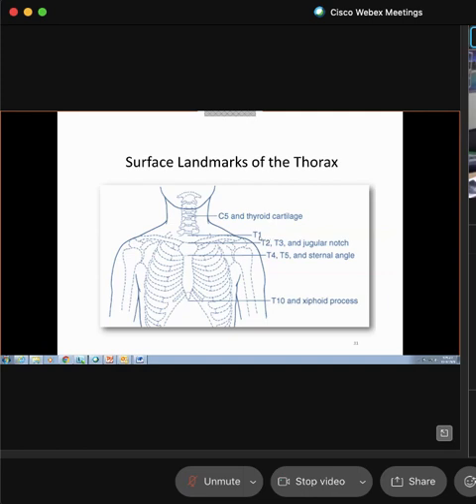When we're centering, or when we're opening up our collimation, if you have the light above the vertebral prominence, then in theory, you have the entire apices of your lungs. Make sense? Because your apices do not extend more superiorly above your first set of ribs. Make sense? Good.